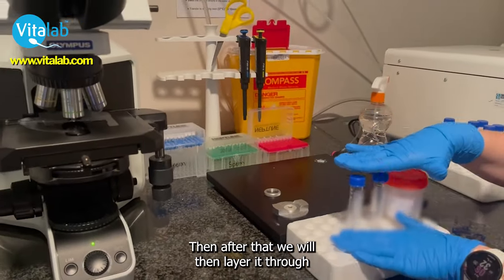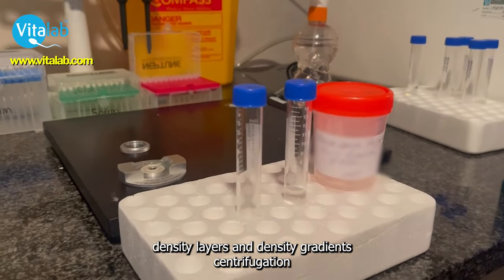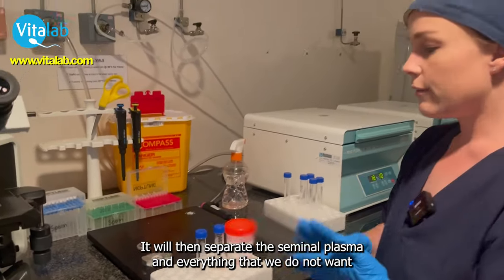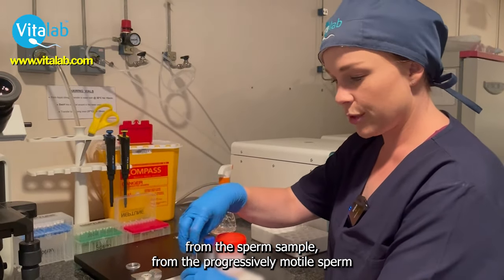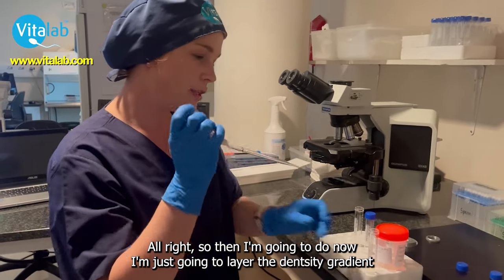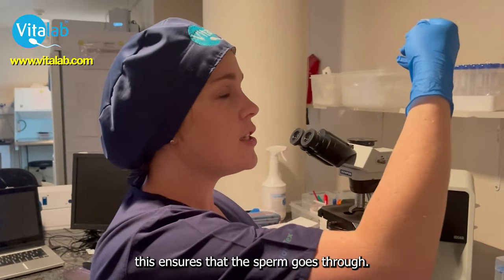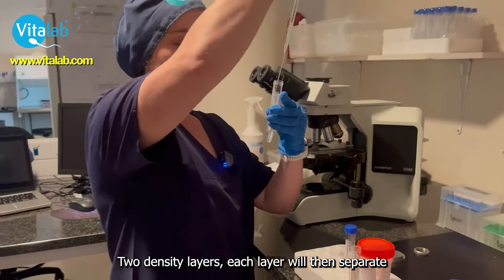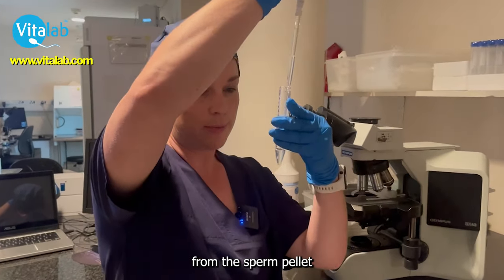After that, we will then layer it through density gradient centrifugation. With the density gradient centrifugation, it will then separate the seminal plasma and everything that we do not want from the sperm sample from the progressively motile sperm — and that's exactly what we want at the end of the day. So what I'm going to do now is just layer the density gradient centrifugation. This ensures that the sperm goes through two density layers, and each layer will separate a different particle from what we want from the sperm gradient.